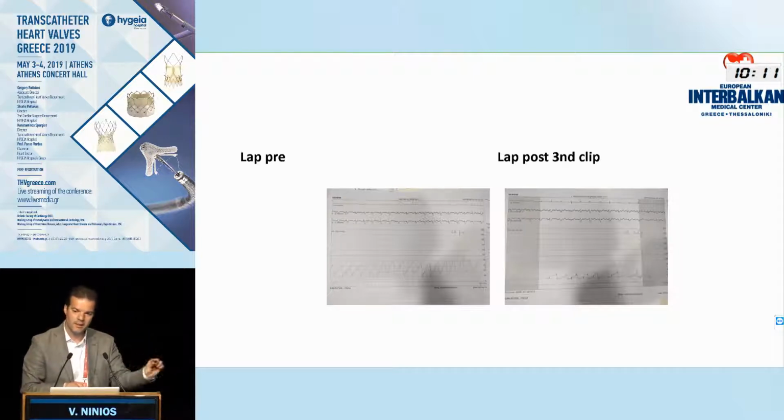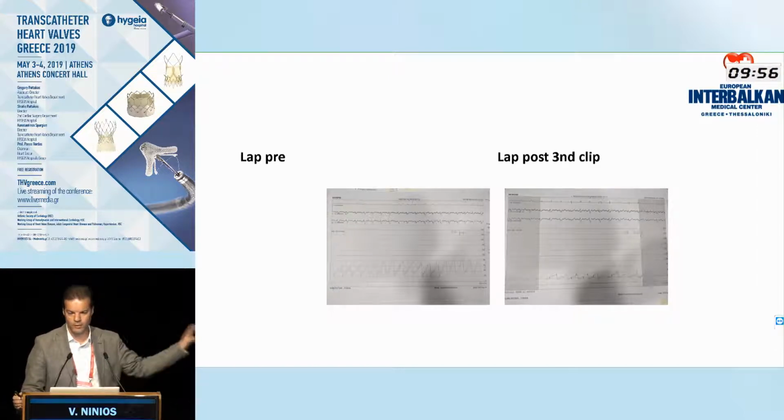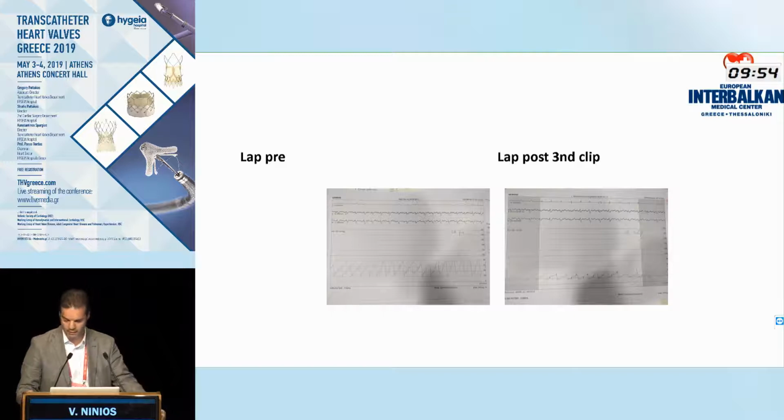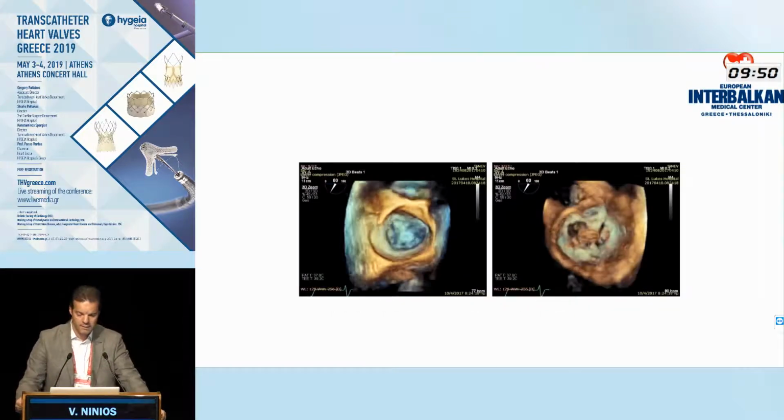This tiny medial jet, 1 year later, this was an intubated patient by the way, became significant. So there was a 2+ MR from this tiny medial jet. So one could have thought to have put even a 4th clip in this medial jet. But I think we did good for this patient, and it was okay. It was an acceptable result that actually saved his life. This is the final result.